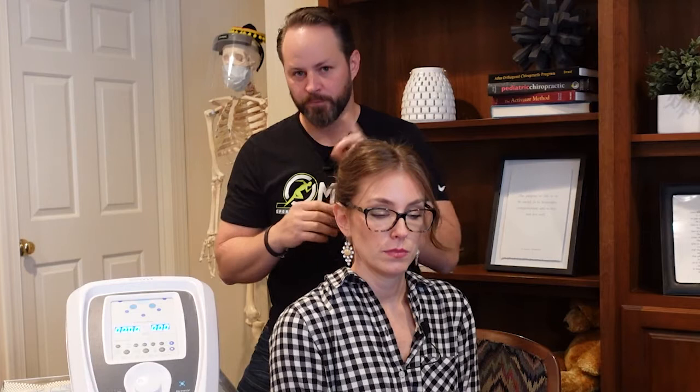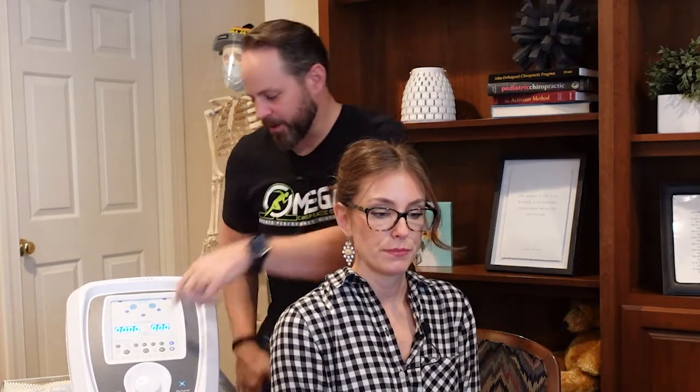Okay. And the wider you go, the deeper it's going to go. So the closer it is, the arc is very small and it's more in the skin area, and it's probably actually going to hurt a little bit. So widen it out. Little nugget there. Great. All right, here we go.